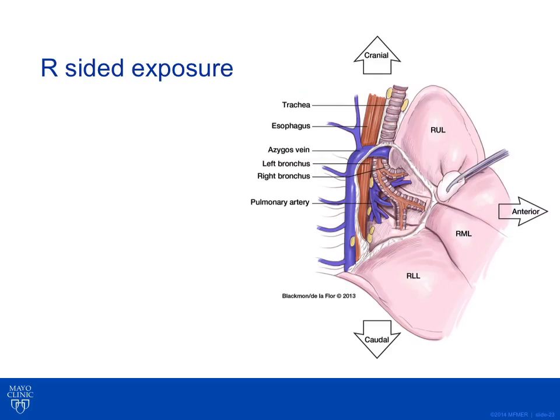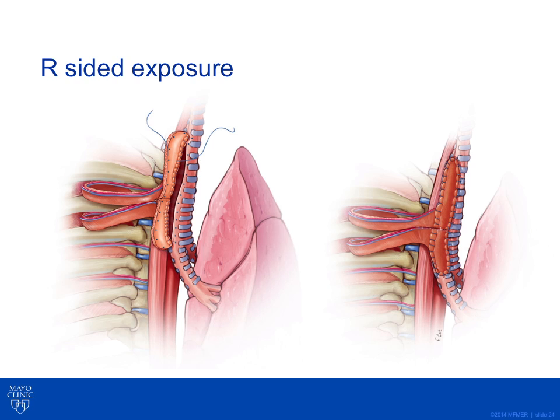A right-sided exposure provided excellent exposure to the posterior aspect of the airway. The intercostal muscle flaps were used in tandem to replace the membranous part of the trachea. Interrupted sutures were used to pexy the intercostal muscle flap and fill the large defect previously occupied by the membranous trachea. By placing a camera inside the chest even with an open thoracotomy, we were able to demonstrate this technique. The actual repair was performed over an endotracheal tube to ensure we were not narrowing the trachea too much.